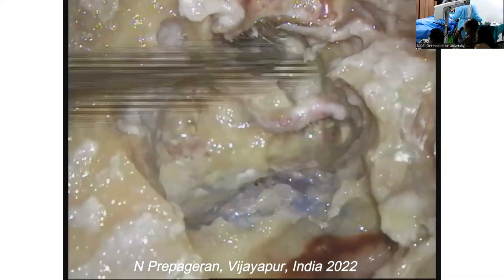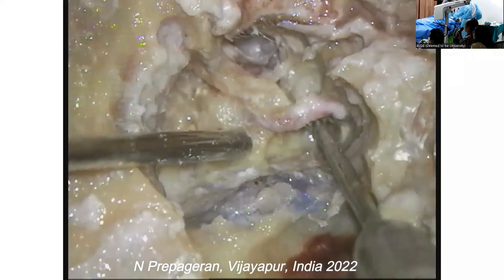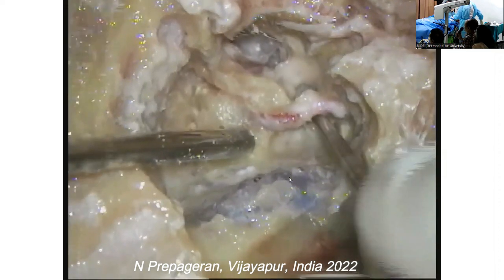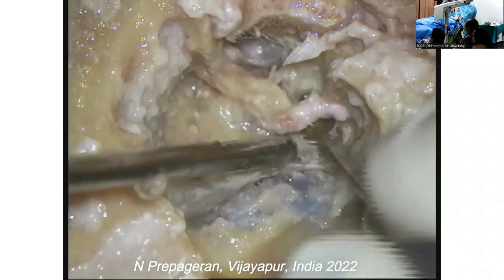If possible, can we see the jugular bulb and carotid side by side with the carotid jugular spine, sir? Yeah, that's what I'm going to do. I'm going to show you. So I'm under the facial now. And that's the jugular bulb.